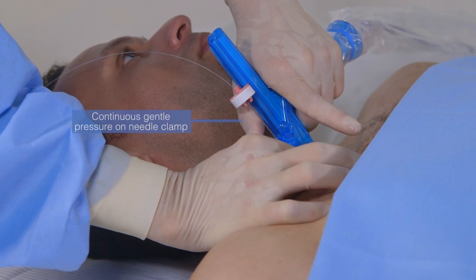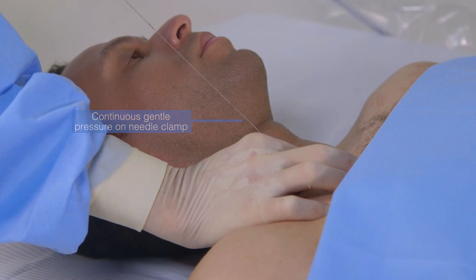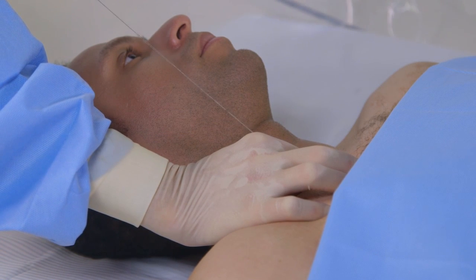While holding continuous gentle pressure on the needle clamp, withdraw the probe and needle over the guidewire, gripping the guidewire between the thumb and first or second finger once the needle tip clears the skin surface. Continue with the Seldinger technique.